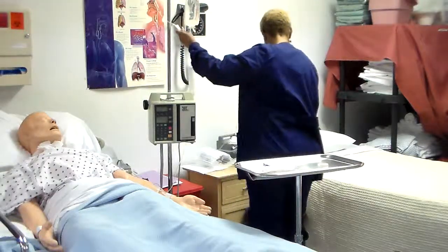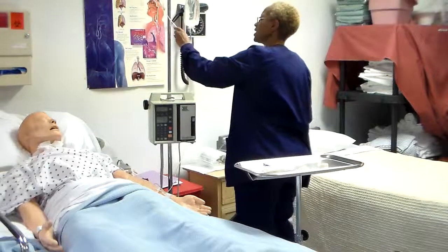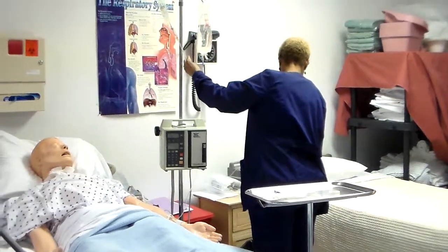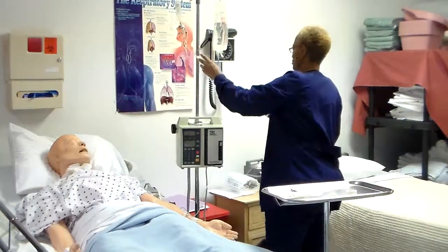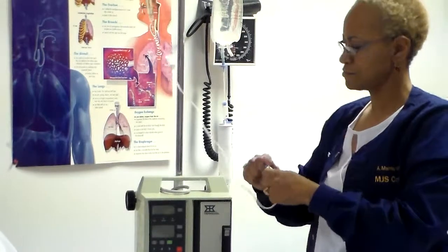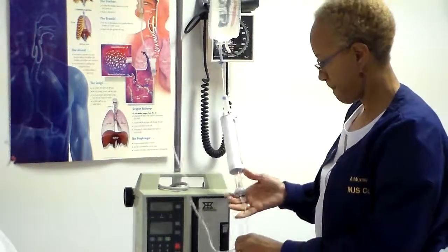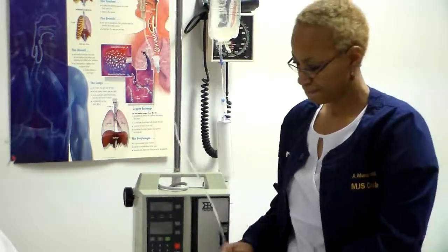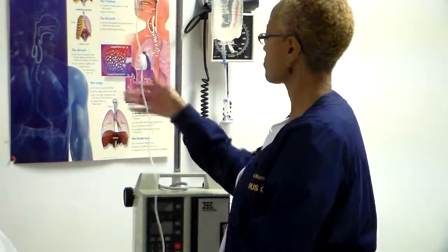To purge through my line. Cover back up my end. All right. Once tubing is full, close clamp and cap end of tubing.